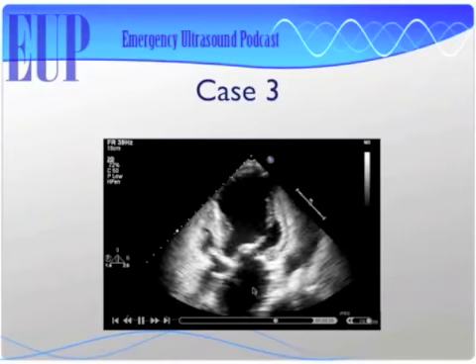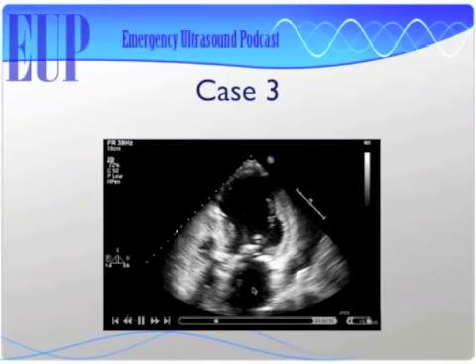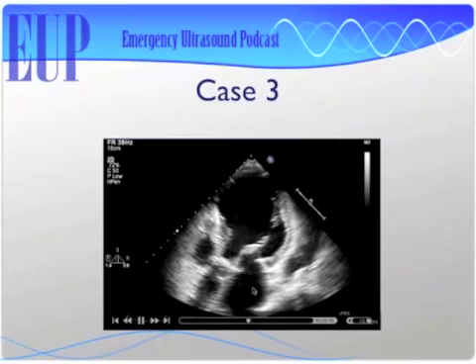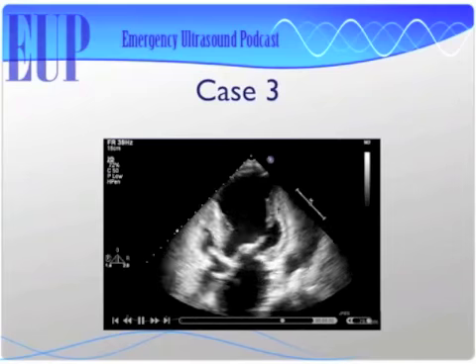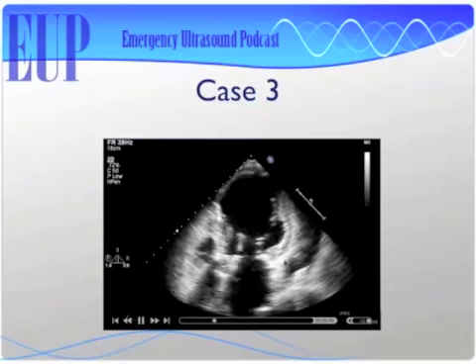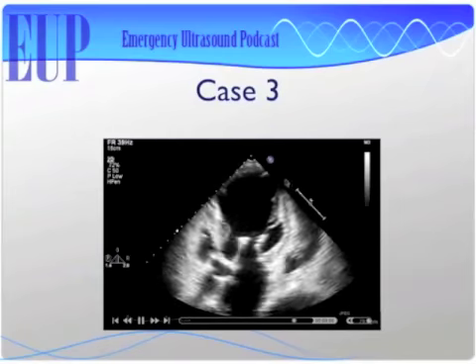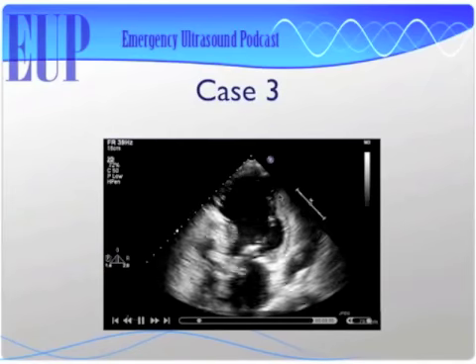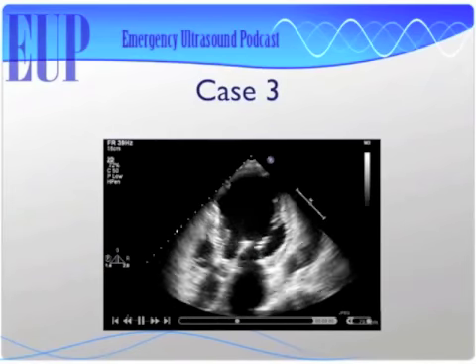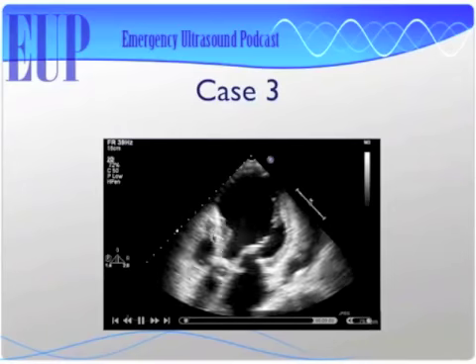Okay. And then is that your lateral or more anterior wall? What is it? Is it your lateral wall that's... You're talking about right over here? Yeah, that's not squeezing very well. Yeah, so this would be actually your inferior wall, right? Your inferior lateral. Yeah. Good job. So we're looking at, so this is actually anterior septum here, right? So this is LAD distribution.